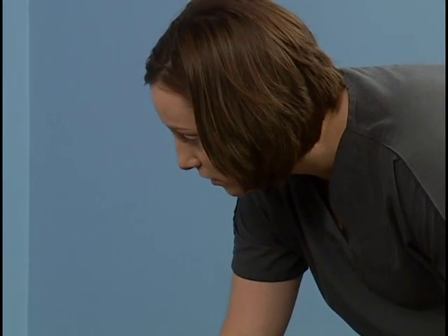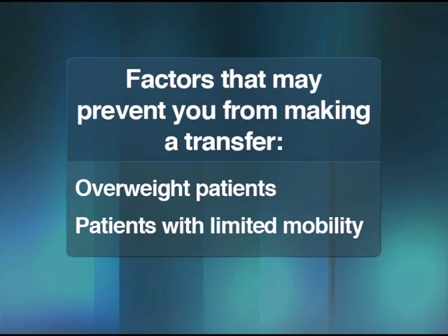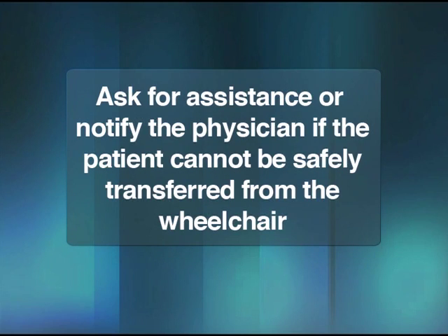Factors which would prevent you from making the transfer include patients who are overweight or patients with conditions that limit their mobility, such as leg paralysis. Ask for assistance or notify the physician if the patient cannot be safely transferred from the wheelchair.